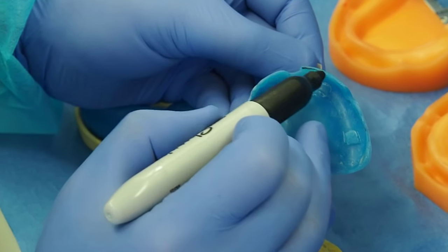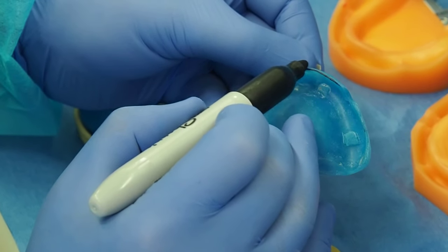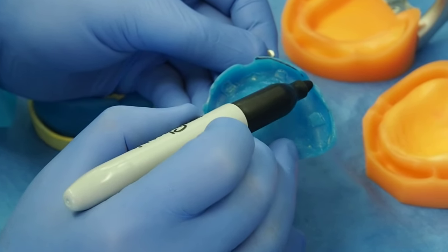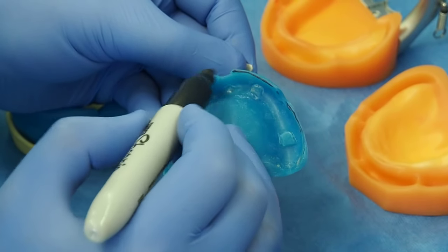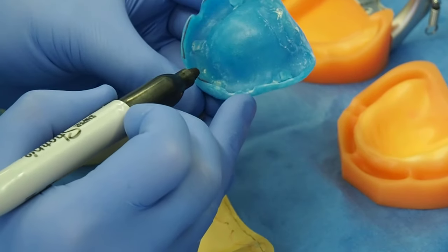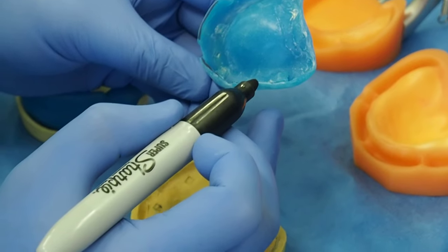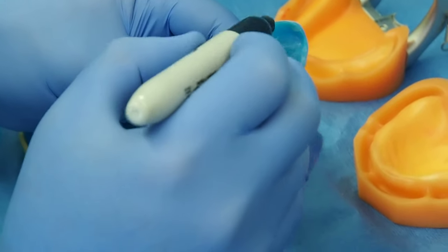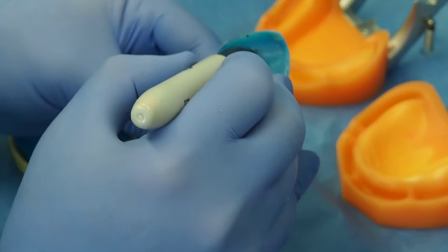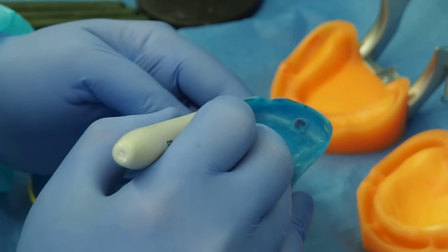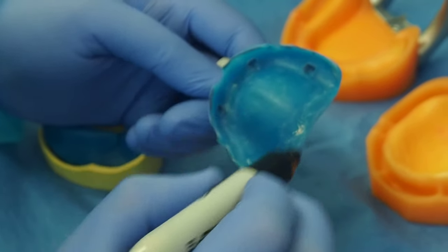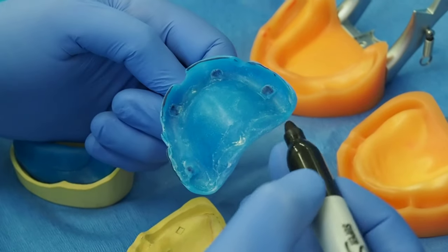It's always good to outline it like this, and then from there just make it thin. Make sure you copy your tissue stops right there, and the posterior seal.